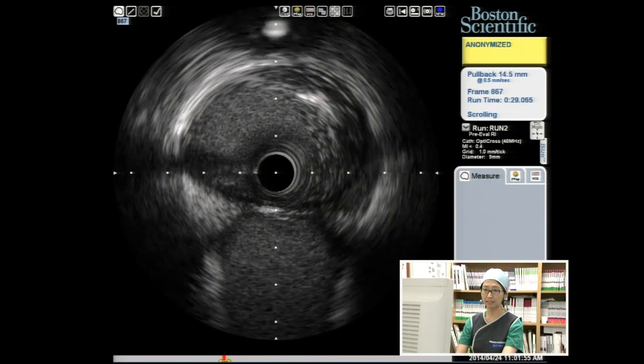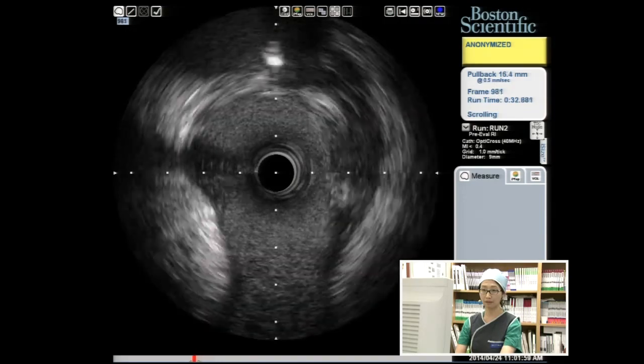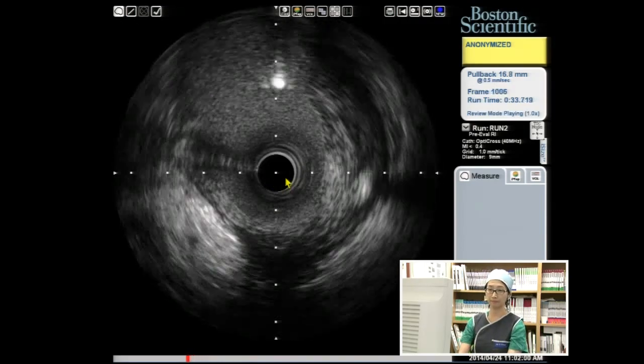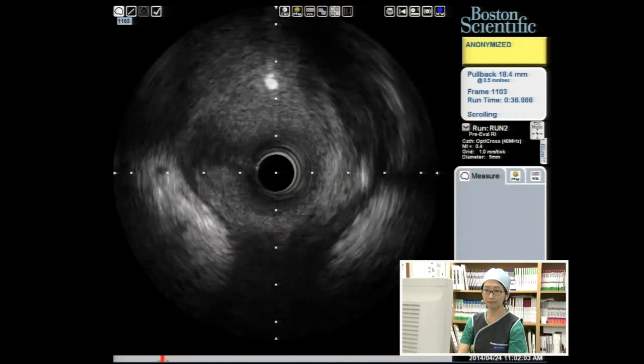And you can see the disease. There is the echolucent plaque, but the plaque is not so large. At the ostium, and then polygon of confluence zone. So just below the frame.